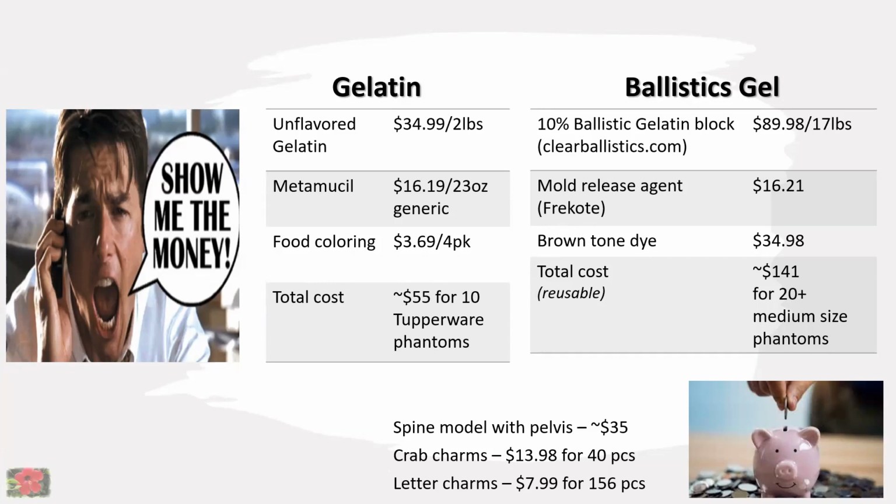How do you store it to maintain it like that? I don't have to do anything for storing other than put it in a closet in my office. Make sure you don't put anything on top, because as I mentioned before, it will take the impression of whatever container you put on it. So make sure it's on a flat surface and nothing on top. So you will need significant space if you're making like 10, 15 models.